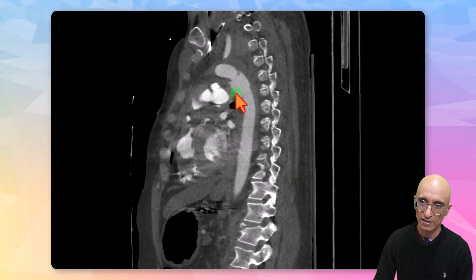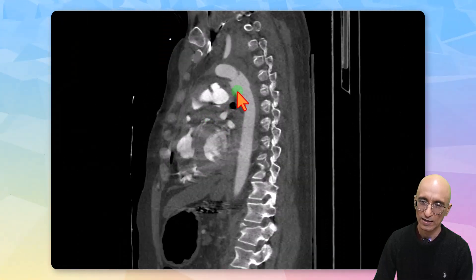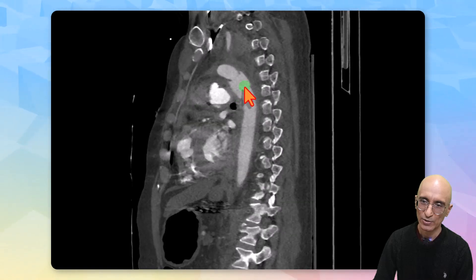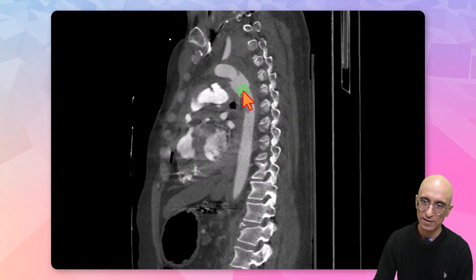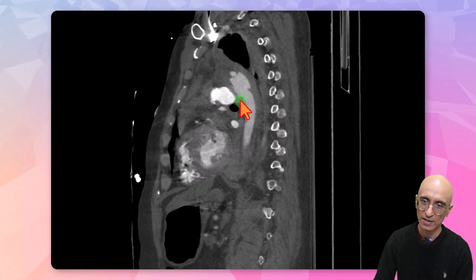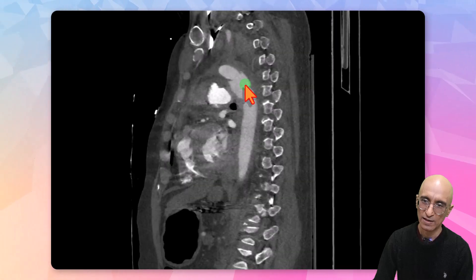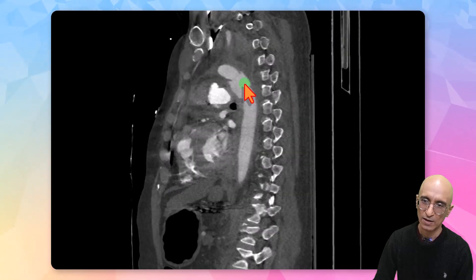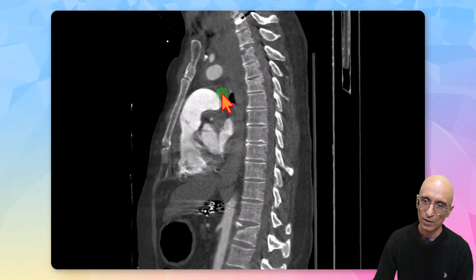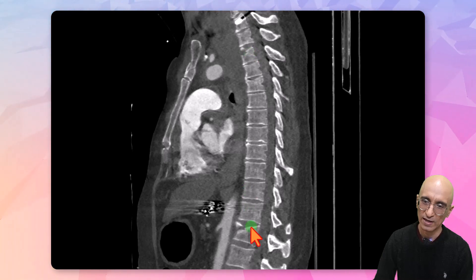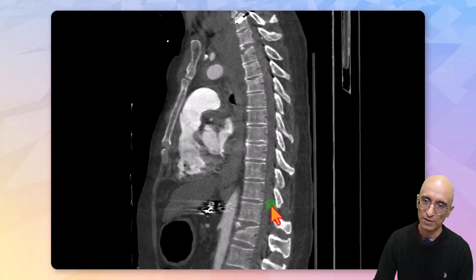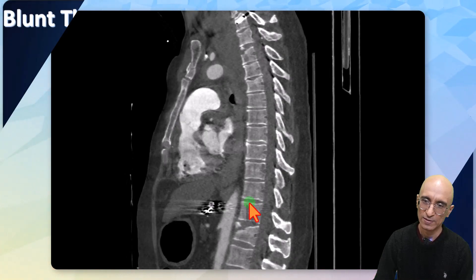On the sagittal images you can clearly see aortic transection in the region of the aortic isthmus at the expected site of attachment of the ligamentum arteriosum. Also notice the patient has fractures of the thoracic and lumbar vertebral bodies.